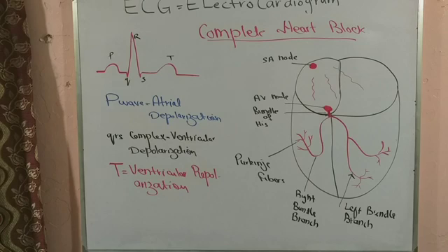It will be the 60 to 90 times per minute P wave on the ECG paper, if the patient has got no sympathetic activation or parasympathetic inhibition of the SA node. But if there is a complete blockage, then only the QRS complexes will be affected. Only the ventricular depolarization will be affected, depending upon which of the two dormant pacemakers, junctional and ventricular, is awakened. If the response is coming from the junctional pacemaker, the ventricular depolarization or the QRS complexes will be 40 to 60 times per minute, and chances are that there will be narrow QRS complexes.